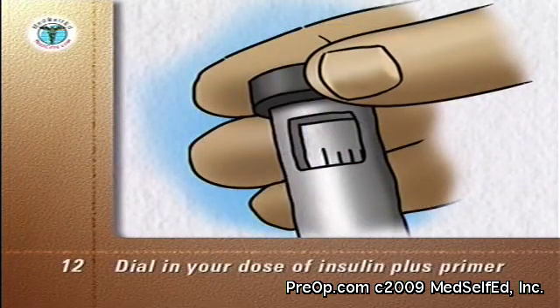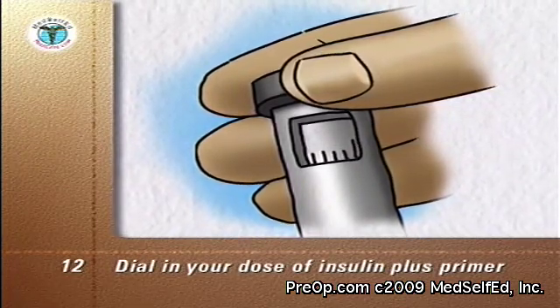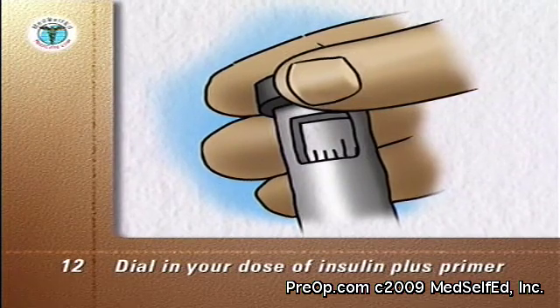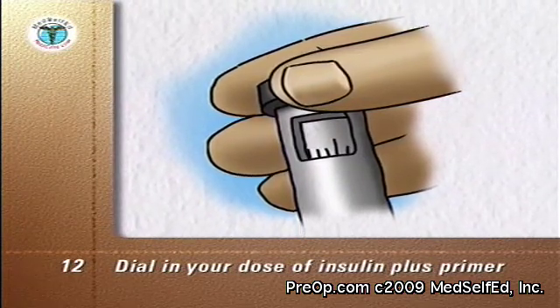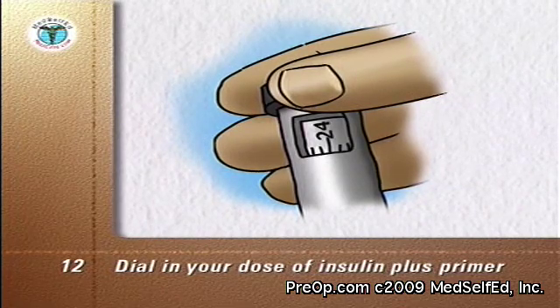Dial in your dose of insulin in addition to the units needed to produce insulin flow. For example, if it took four units to start the insulin flow and your insulin dose is 20, the total in the dose scale window will be 24.